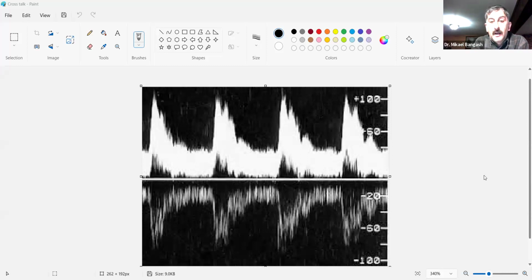You may be asked what your Doppler shift is. You may be looking at it and say, well, I see something on the positive side, I see something on the negative side, and wonder which of these two here is the real Doppler shift.